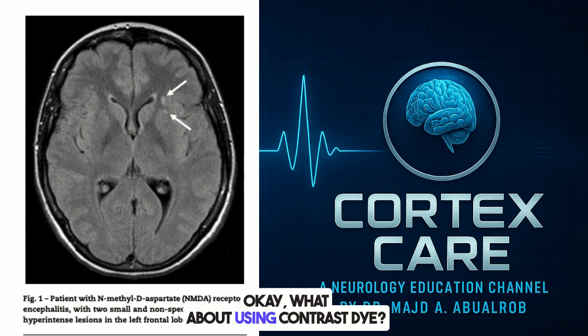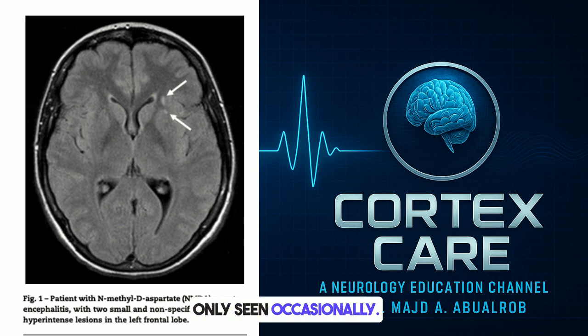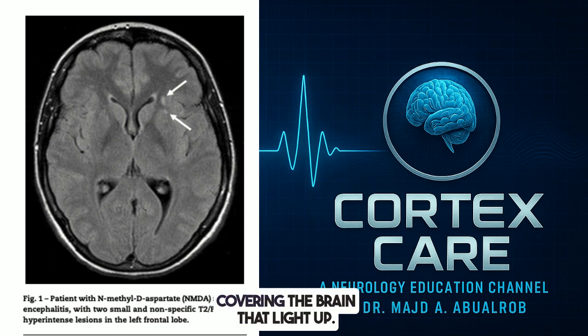What about using contrast dye? Does that typically highlight anything? Contrast enhancement is only seen occasionally. When it does happen, it's usually the leptomeninges, those membranes covering the brain, that light up.